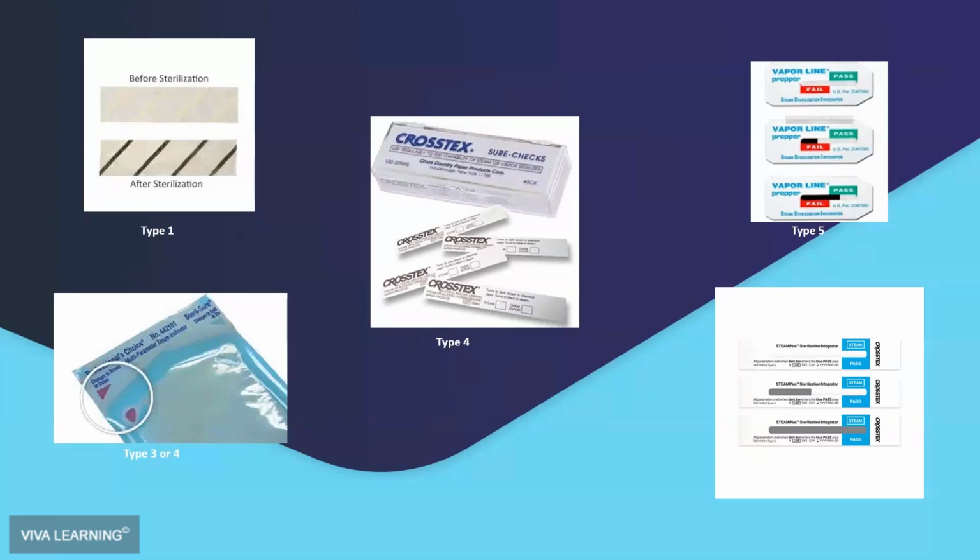Now, having said that, please don't go and dunk your X-ray sensors into the high-level disinfectant. Follow the manufacturer's instructions. Always follow those instructions. And if you can protect those items with a barrier, especially the electronics, the sensors, the intraoral cameras, then that is what you do. Make sure you always read the manufacturer's instructions for those electronic items that you shouldn't have in contact with any chemicals. So be careful, read your instructions. There's not one hard and fast rule.